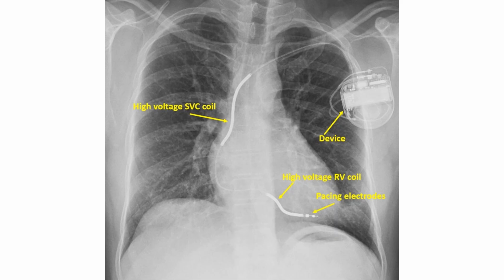These new types of ICDs have been innovated to avoid the potential problems with transvenous leads in the conventional ICD system. Leads in the vascular system can get infected, can get fractured or dislodged, and occasionally perforate the cardiac chambers. Lead can also lead to intravascular thrombus formation. For these reasons, lead has been called the Achilles heel of most cardiac implantable electronic devices, which include pacemakers and ICDs.